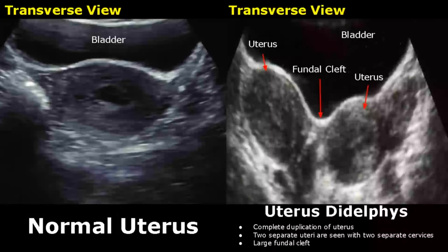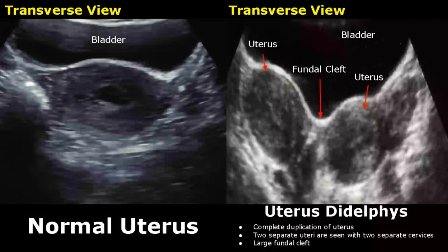Hello everyone, this is Dr. Sam and this video is about congenital uterine abnormalities on ultrasound. Congenital uterine abnormalities occur during embryonic life and are types of Müllerian duct anomalies. These are transabdominal images of the uterus.